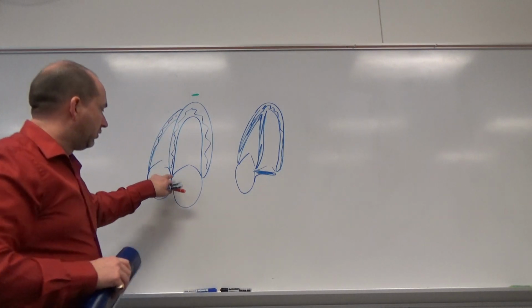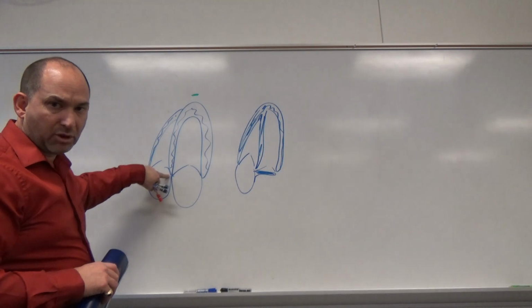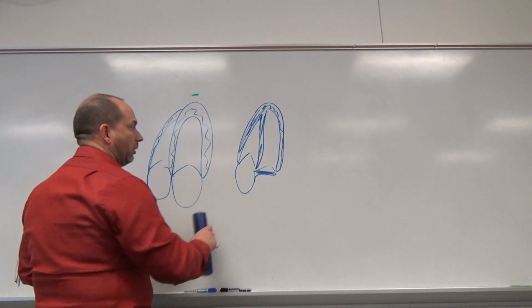The other thing that we're going to run into is if we tip too anteriorly, you're not going to have a nice conformation of the valves here. You can actually open up into the aortic valve, which you do not want to do at this point.